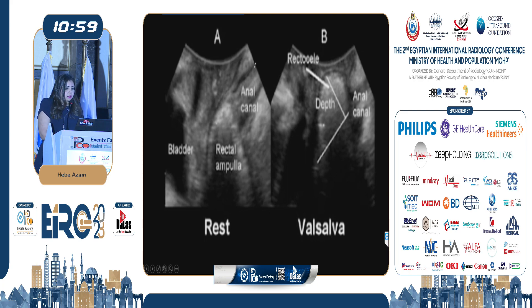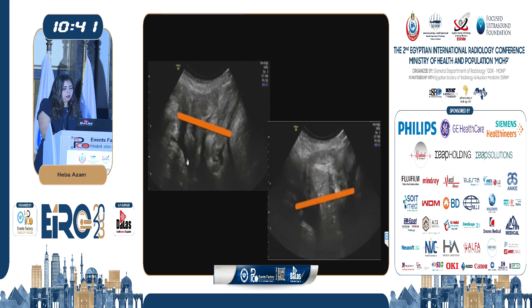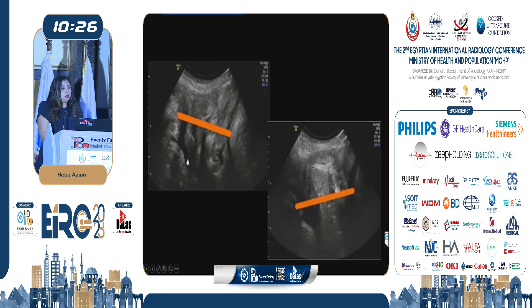In this case, the resting image shows the anal canal and rectal ampulla. During straining, there is bulging of the anterior rectal wall into the posterior vagina, forming a rectocele, and we can measure the depth of the rectocele. In another case, during straining there is bulging of small bowel loops between the rectum and vagina, indicating an enterocele.